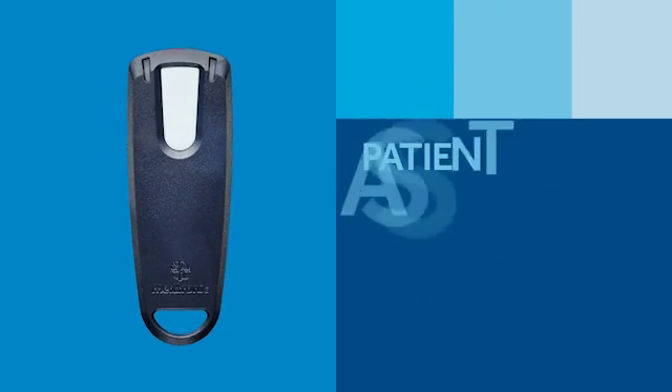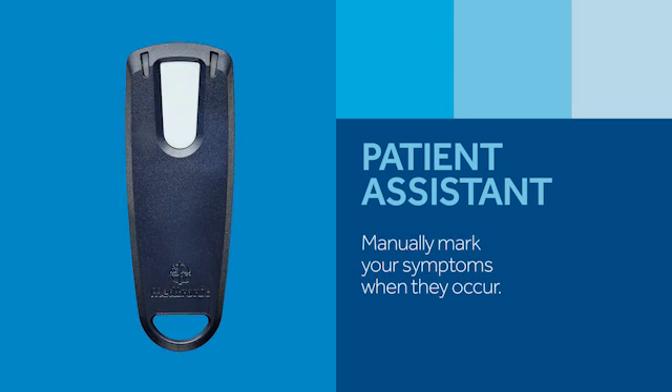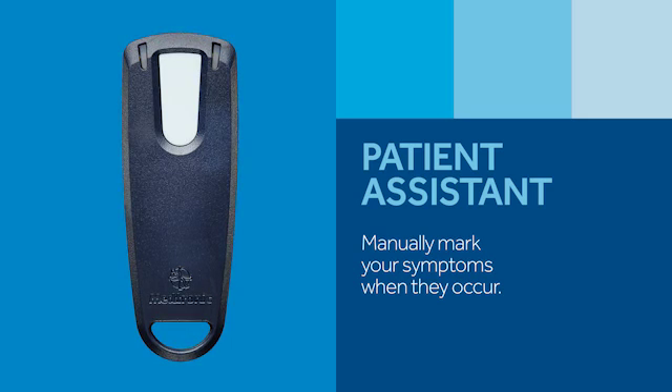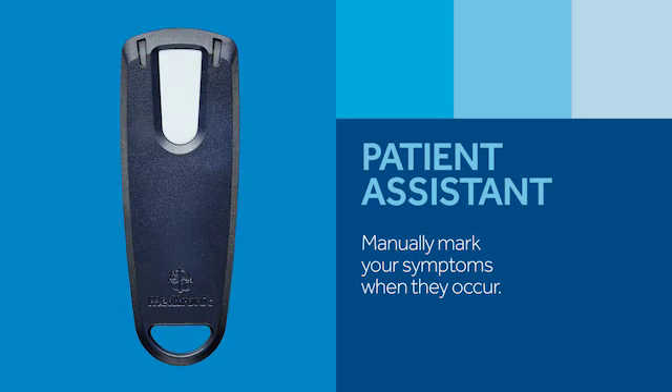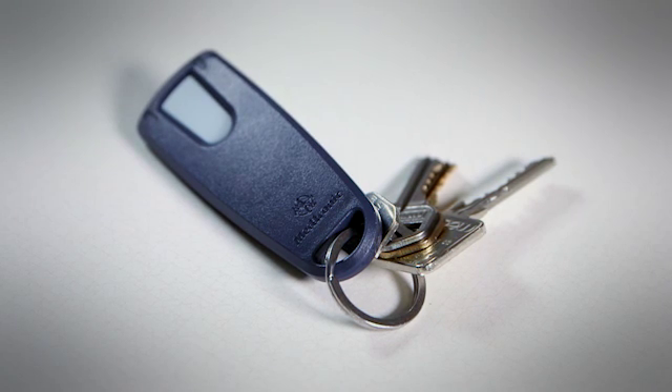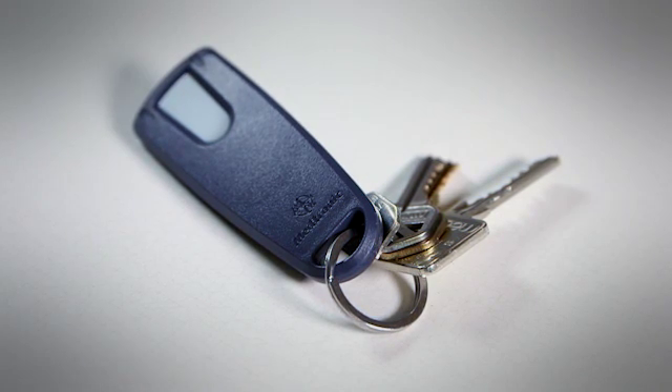Depending on your symptoms and the reason for your heart monitoring, your doctor may provide you with a patient assistant. This small handheld device allows you to mark your symptoms in your Reveal Link ICM when you feel them, such as dizziness, fainting, or palpitations. Later, your doctor will be able to view what your heart was doing at the time your symptoms occurred. If you received one, carry it with you at all times so you have it handy in case you experience a symptom. You'll have about five minutes to mark a symptom with the patient assistant — otherwise, just write down the day and time of your episode to share with your doctor later.